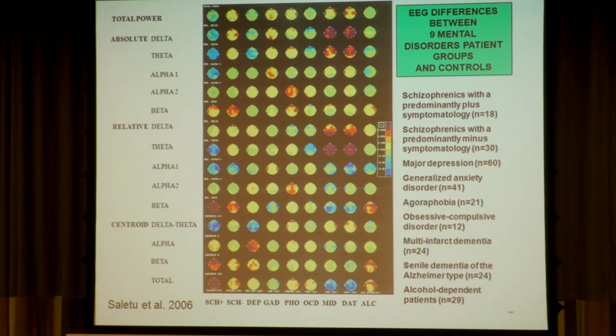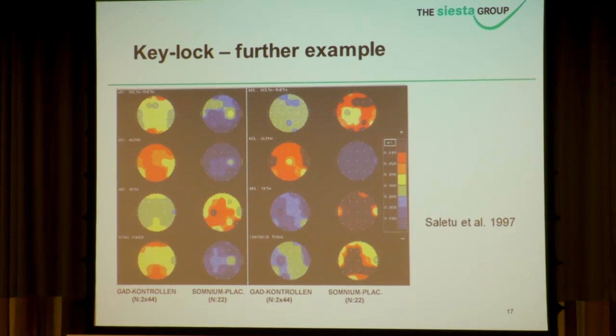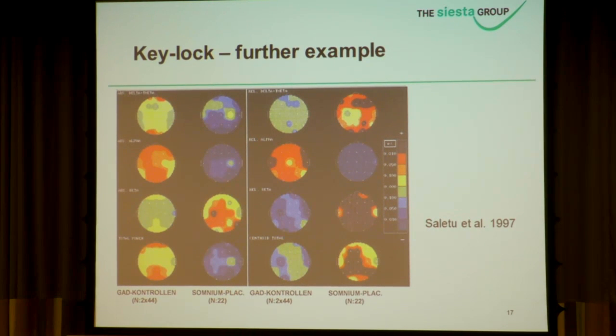To highlight one example, it's certainly not a perfect thing. One limitation is that when you look into controls, one of the variables might already be at the maximum. You cannot increase or further decrease it anymore, so you might not see that effect as nicely as we show it here. But overall, the work here shows that it's an extremely useful tool of looking at the EEG results this way.